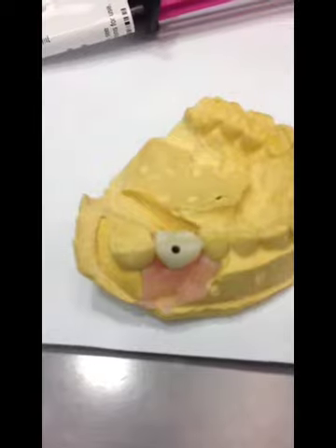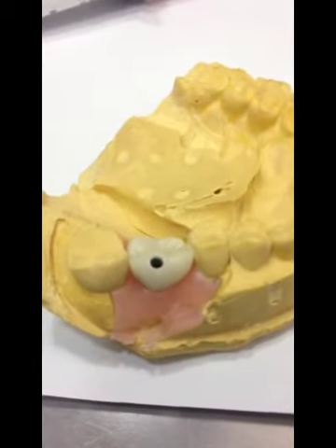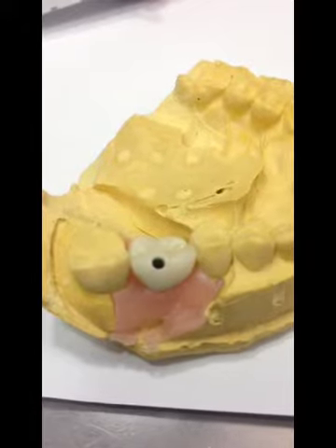And we're going to cement this using Reliax Luting Plus out of the mouth. We're going to etch both the abutment as well as the crown, and then we're going to bond both surfaces, and then we're going to cement it with the Reliax Luting Plus.